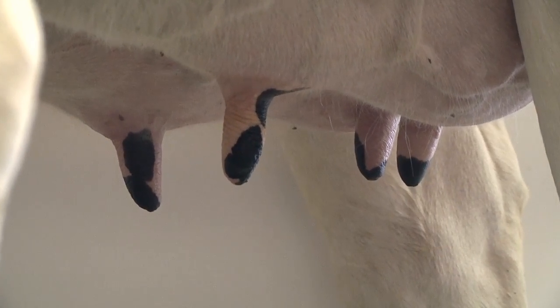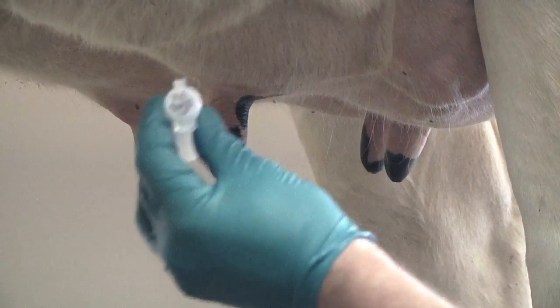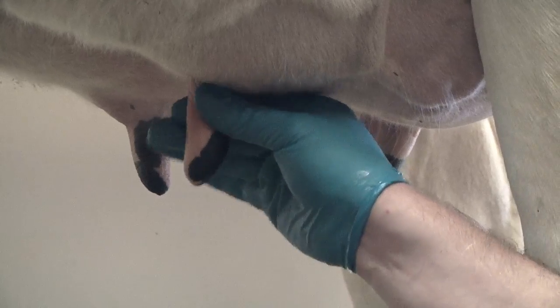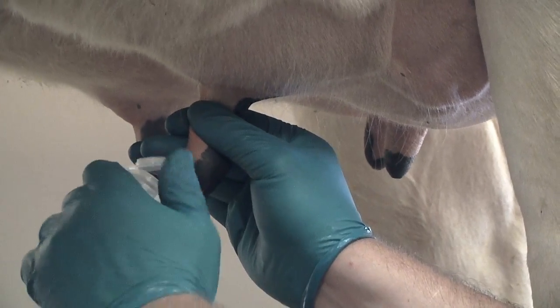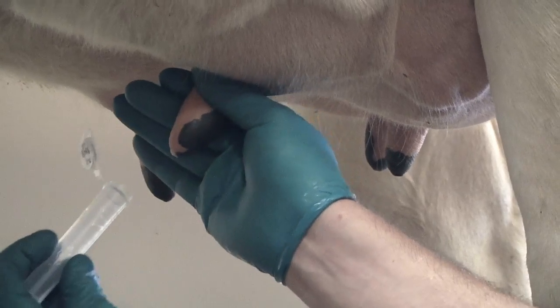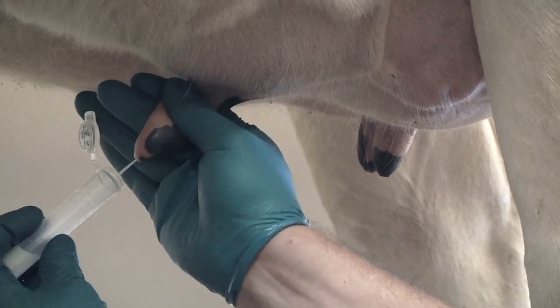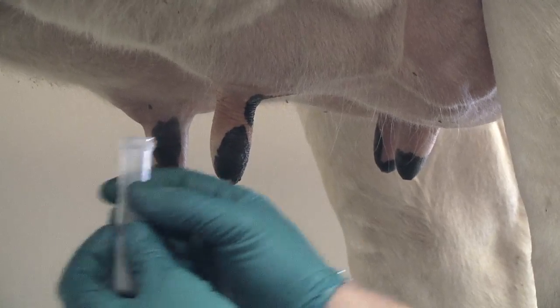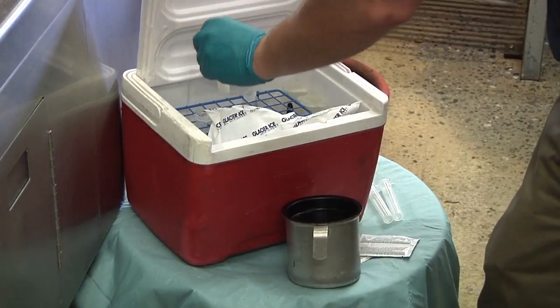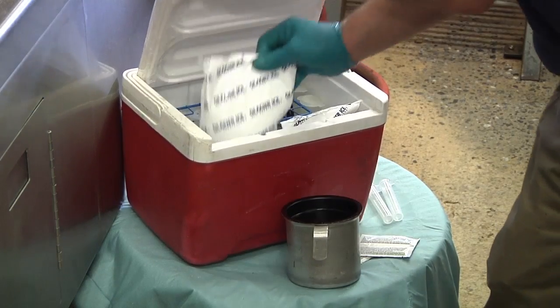Scrub the teat end with an alcohol-soaked gauze or wipe and repeat if there is dirt on the swab. Strip out the first several squirts of milk onto the floor. Open the sample tube and hold the tube at an angle to prevent debris from falling into the tube and contaminating the sample. Squirt out several milliliters of milk into the sample tube.